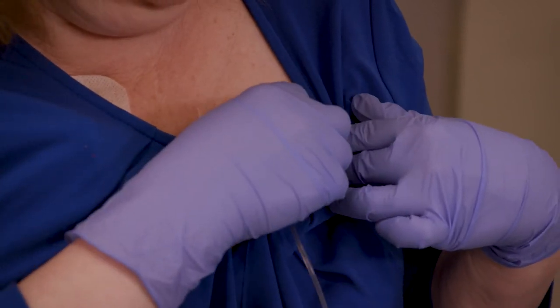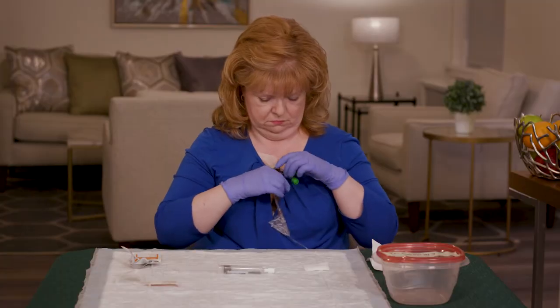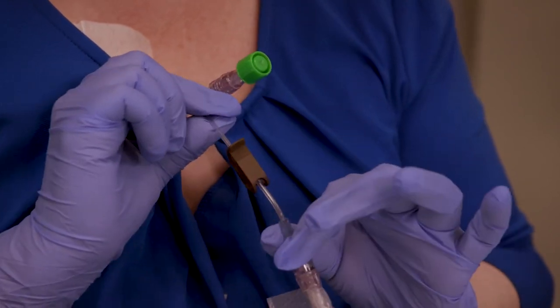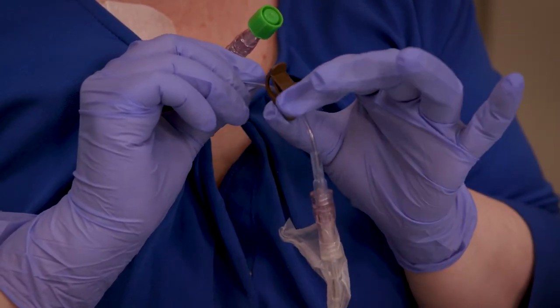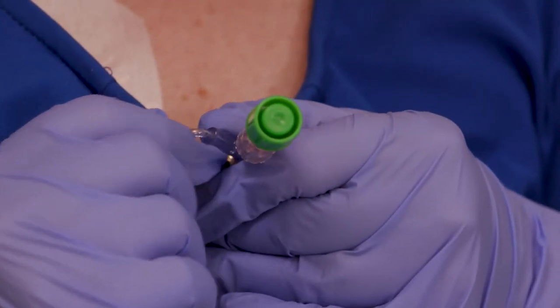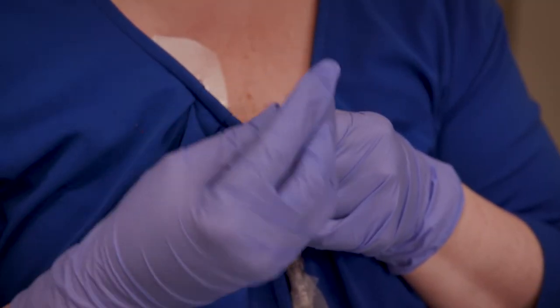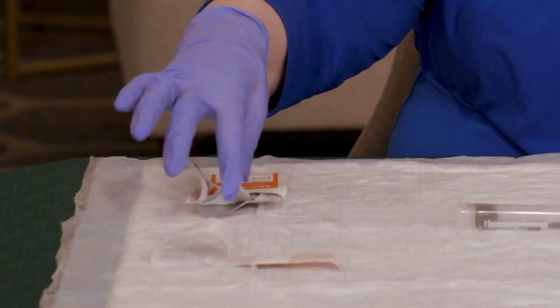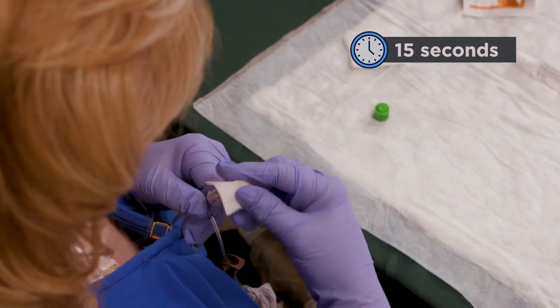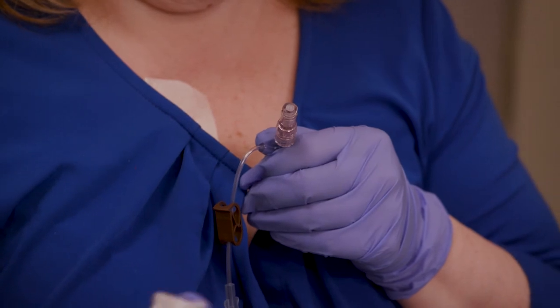Gently remove the tape and flow restrictor from your skin. Then pinch the clamp closest to the elastomeric pump closed. You'll know it's properly closed when it pinches the clear tubing and you can't slide it up or down. Between the clamps, you'll see a needleless connector with a green disinfection cap. Remove the cap by twisting it to the left. Scrub the end of the needleless connector with the alcohol pad for 15 seconds, then let it dry for 15 seconds.